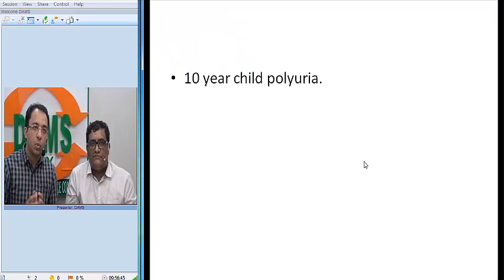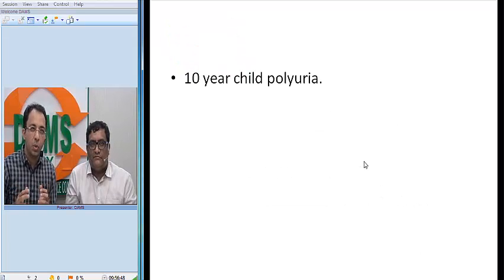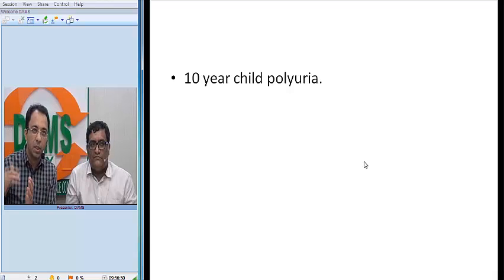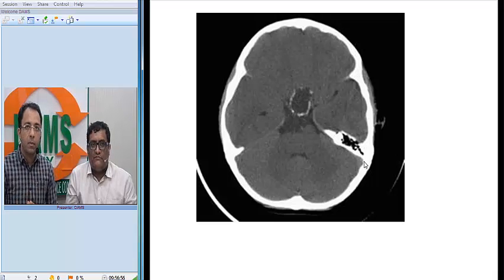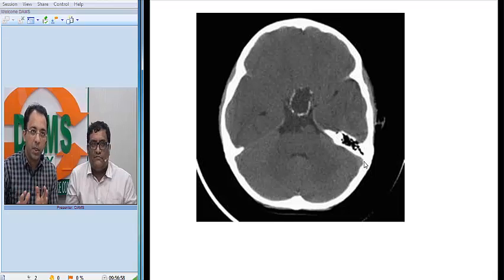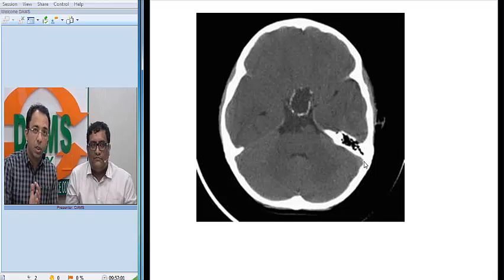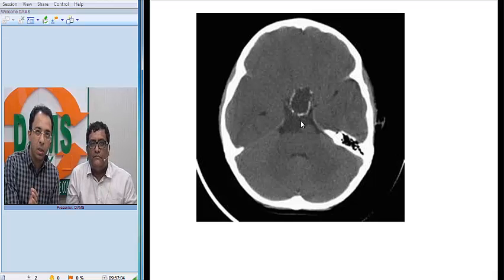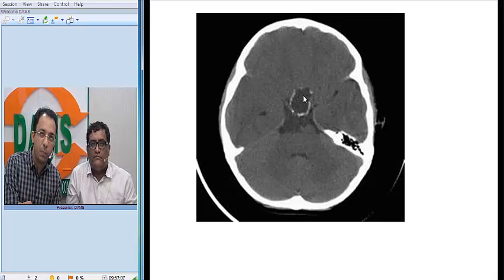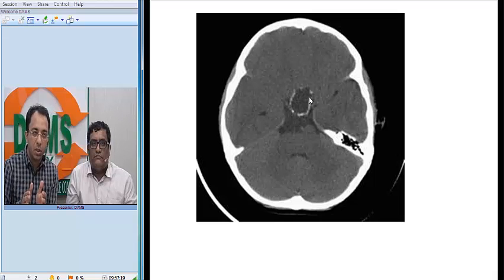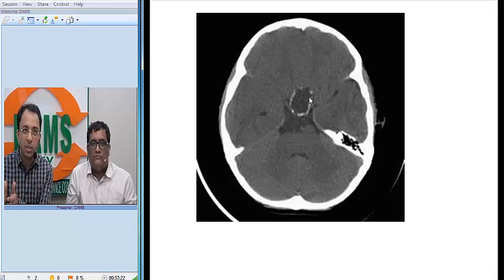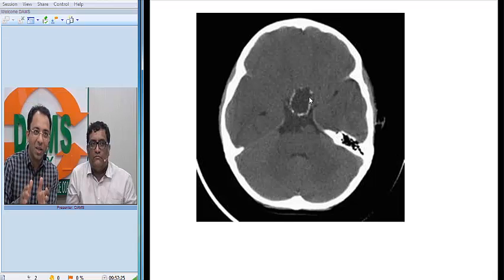We have a patient who is a 10-year-old child, so when you see a 10-year-old child, I am thinking of pediatric diseases. The presenting complaint is polyuria, and he comes with a CT brain. On this plain CT scan of the brain, you are able to see in the area of the suprasellar cistern a lesion which is hypodense, predominantly cystic, and has a calcific outline — a rim-like calcification. Many of you are already making a diagnosis.